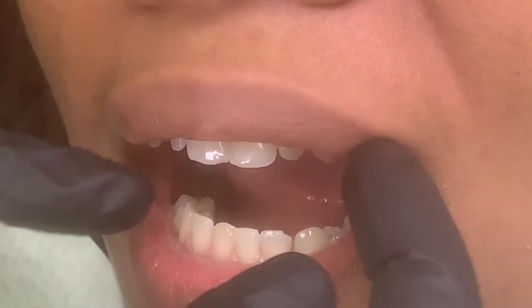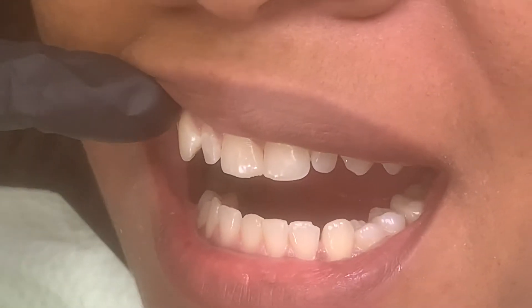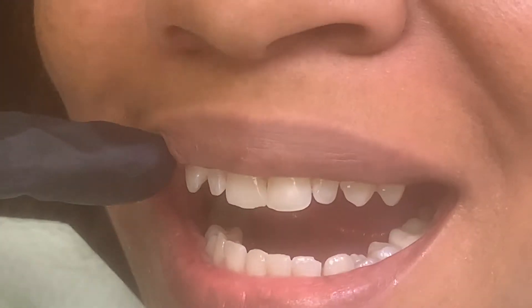Snap-on smile can do a lot of things. It can not only enhance the color of your teeth and make it more symmetrical, but it can fill in the missing spaces as well, and you can eat and drink.